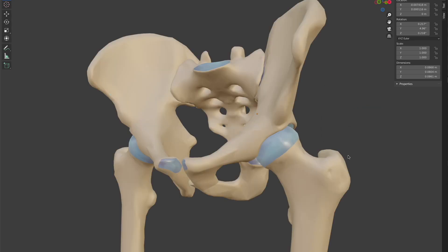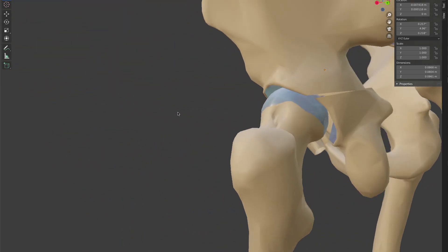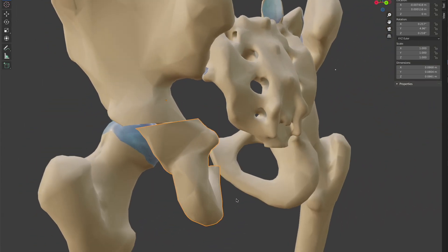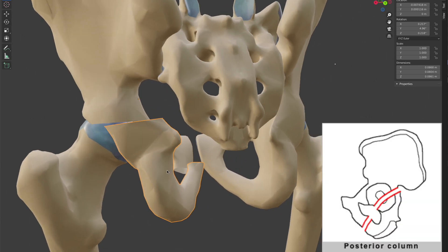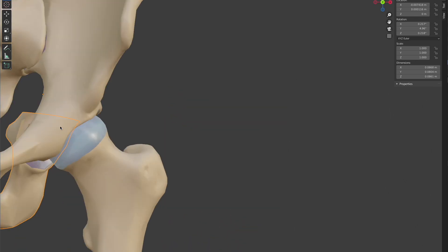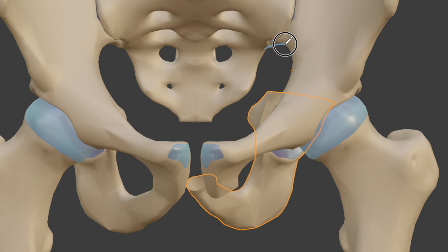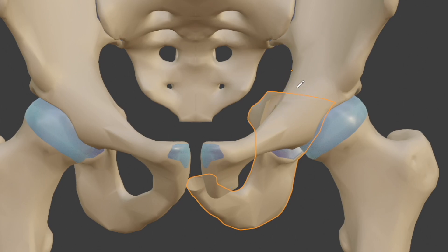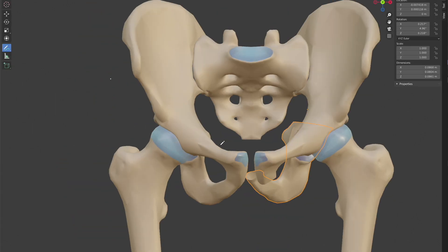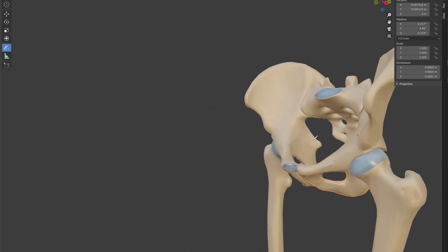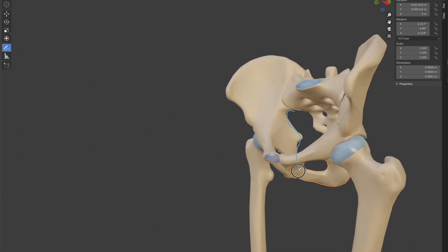Looking at the model, there is a definite fracture in the posterior column — it is no longer intact with the rest of the pelvis and has been displaced mainly medially with slight rotation. Using the lines drawn earlier, the ilioischial line is clearly disrupted with a very sharp turn at the identified point. On the right Judet view there is an obvious disruption of the smooth line, and comparing left to right confirms the right side is clearly disrupted while the left is smooth.